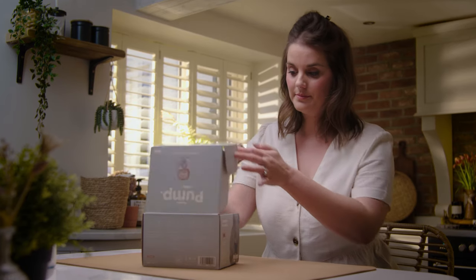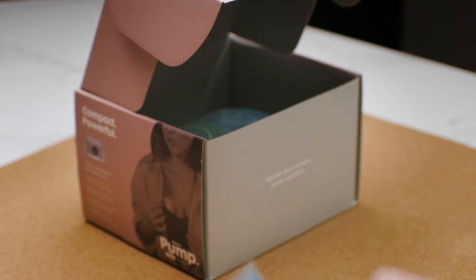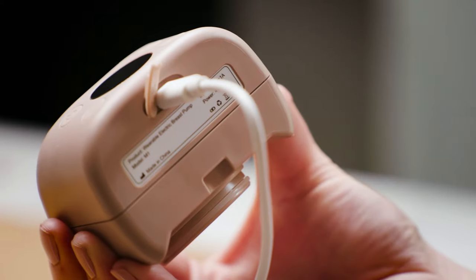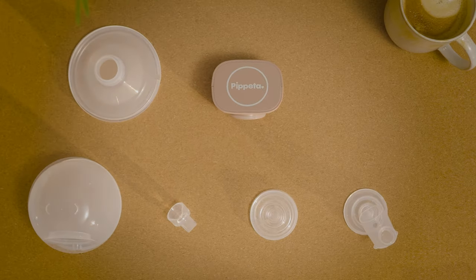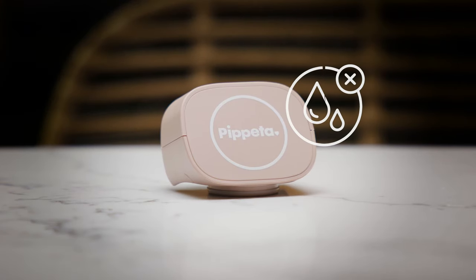Everything you need to get started with the Pippeta Pump is included in the box. Within the box, you'll also find the manual and spare parts. Before your first session, make sure you charge the Pippeta Pump fully for the best battery life. Also clean and sterilise just the washable components. Remember, the Pippeta motor should always be kept dry.